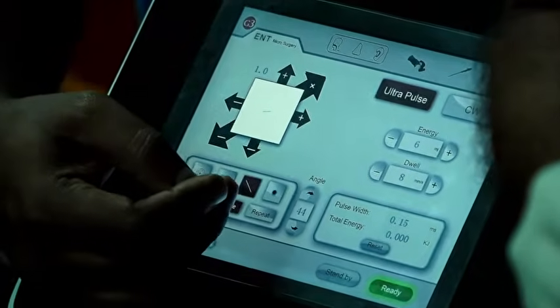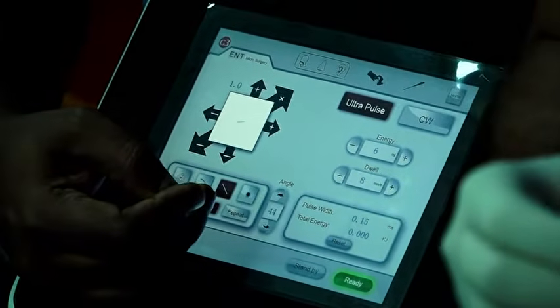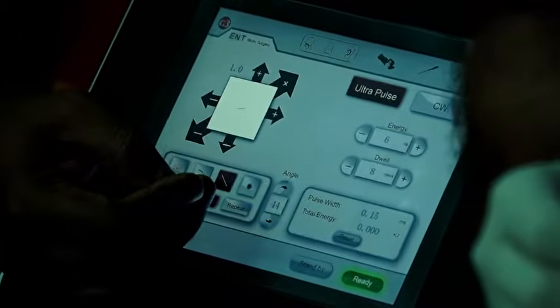Okay. So once you are using the blade, stick, it can move. So you can see the incision there. Again extend the incision down.